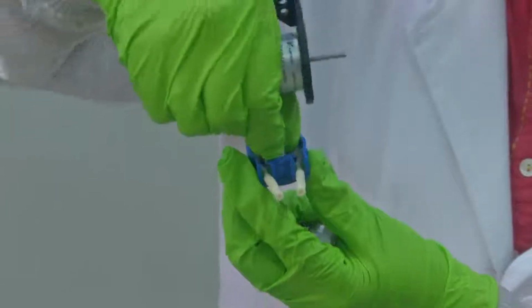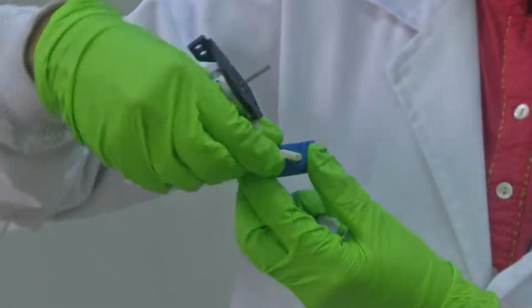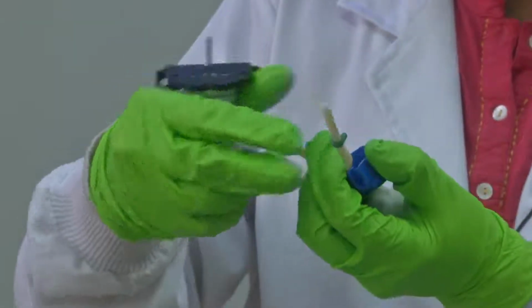These rollers compress the outer surface of this tube. So here is the tube.